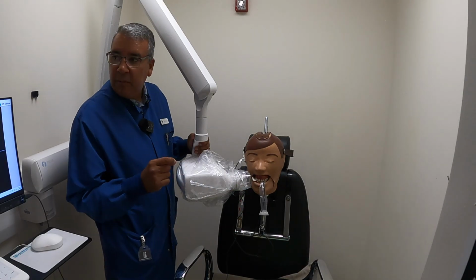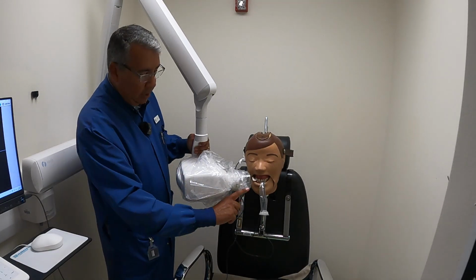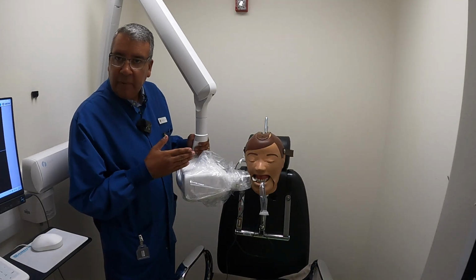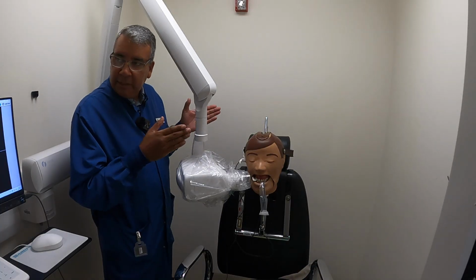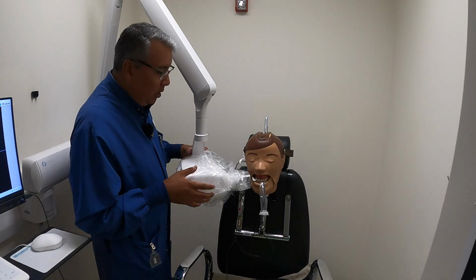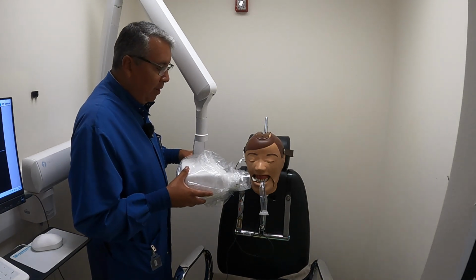If you just cover the canine, you'll probably wind up getting a cone cut. So we have to pass it. By passing it by one tooth, it centers your sensor in the center of this PID. We okay so far? I got my horizontal. I got my vertical.